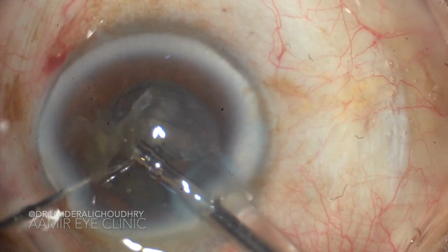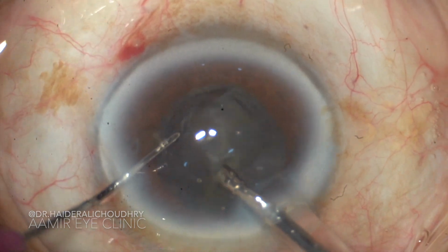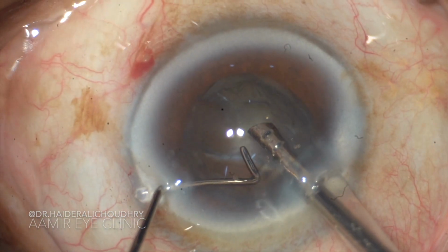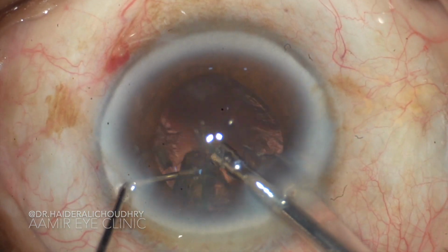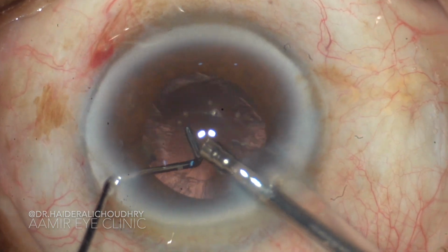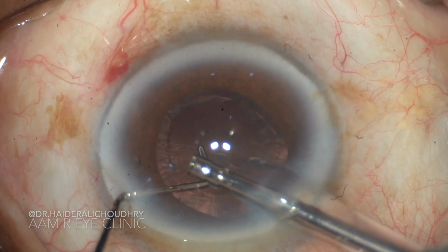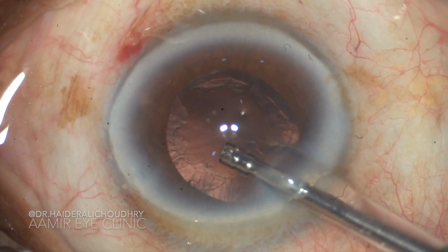After getting the last fragment of the nucleus, we go for the epinuclear shell while placing the chopper in a protective position between the phaco tip and the posterior capsule, preventing any risk of a posterior capsular rent while a surge that you often get while aspirating the last piece.